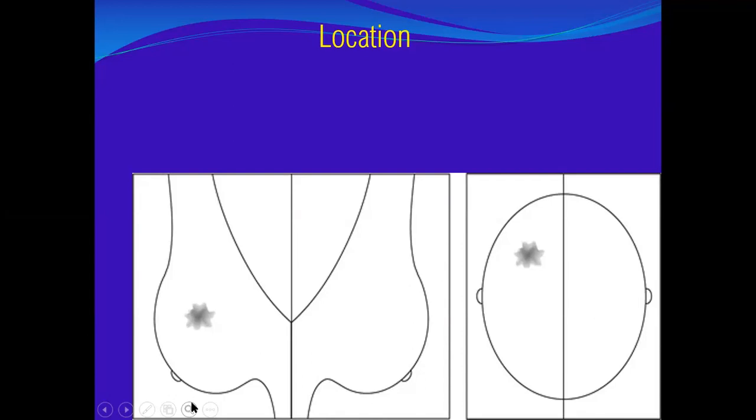Even before we said, what are the remaining descriptors regarding the location? We mentioned we have many descriptors. First, laterality, right, left. Second, quadrant, and clockwise. Then in CC, outer, middle, or inner. Okay, so the depth.